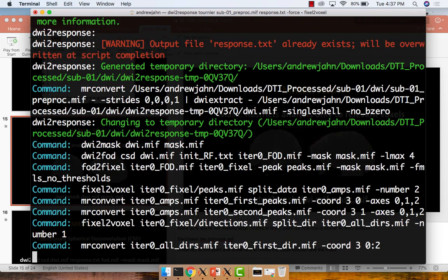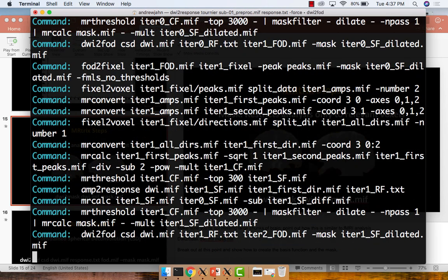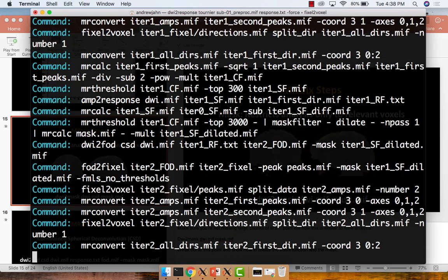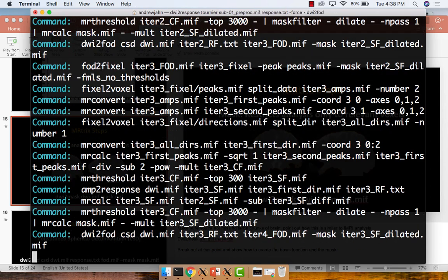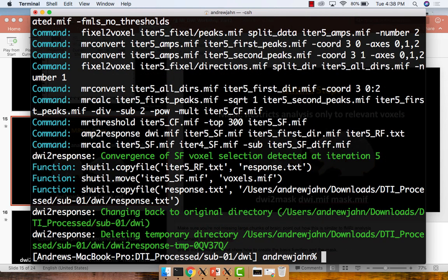So each subject has a different basis set? Slightly, yeah. They're not radically different, but they are different. Do you know why? What's the advantage of that? I'm not entirely sure. They seem to say that it gives greater specificity, maybe more power. These things don't look that different from what I've seen, but they are modulated at each voxel to try to best fit the data. I'm not sure exactly what they're trying to look at within each subject, like what actually differs with this basis function.